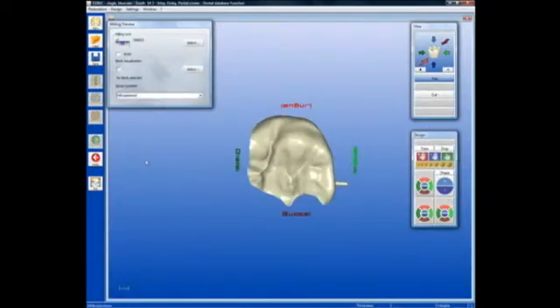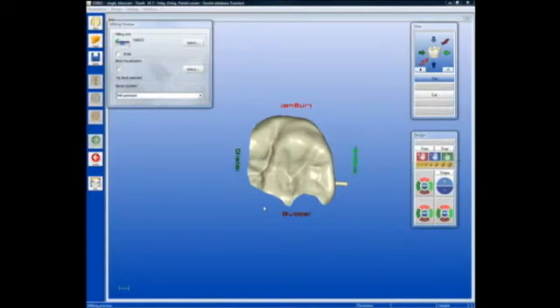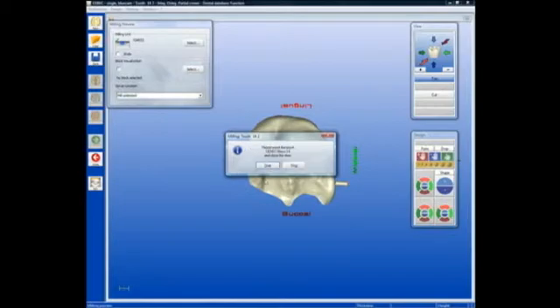At the milling preview, we simply hit mill, and then select the type of block and the size, and click OK. At that point the milling instrument will prepare itself to receive the block of ceramic, and then we can simply hit start either from the screen or from the milling unit itself in order to begin the milling procedure.